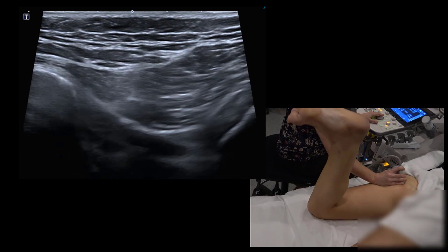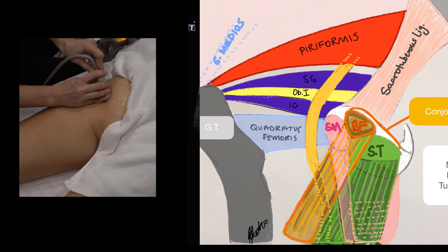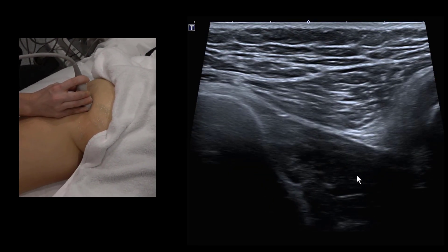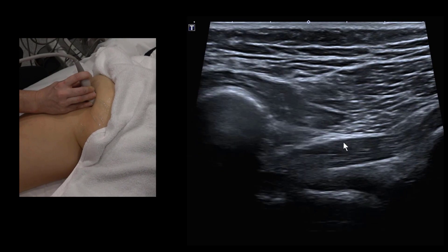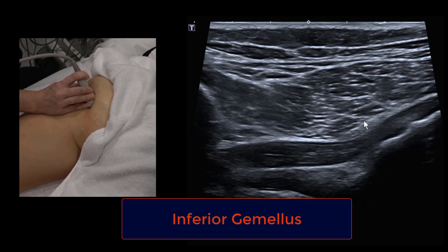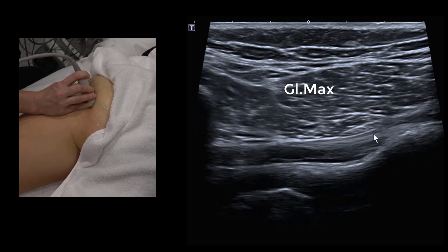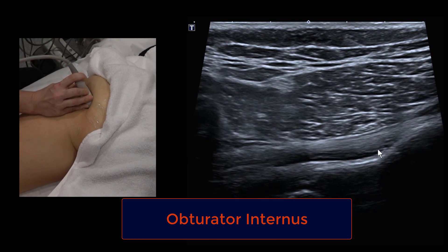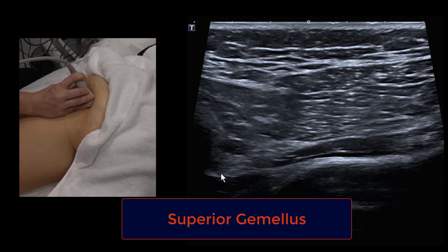Now moving on to the obturator and gemelli — there are two gemelli muscles and one obturator internus. Moving superior to the quadratus femoris, the muscle insertion shifts from pointing towards 10 o'clock to pointing down to 8 o'clock — this is inferior gemelli. Moving more superiorly, the muscle disappears and we see an echogenic fibrillar tendon — the obturator internus, which has its own bursa.